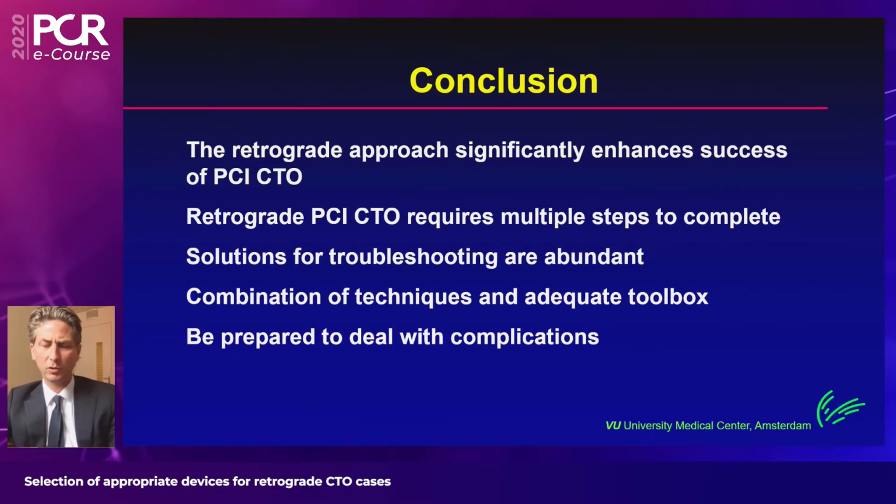You're frequently with reverse procedures. In over 75% of cases, you're going to be committed to reverse CART, and you need to have all the steps and troubleshooting techniques to deal with complications, because complications are more frequent with the retrograde approach than with the antegrade approach. So learn all these tips and tricks and be prepared to deal with complications. But once you have gotten your toolkit and your skill set, your success rate is going to be 90% and higher, which is going to be worthwhile.